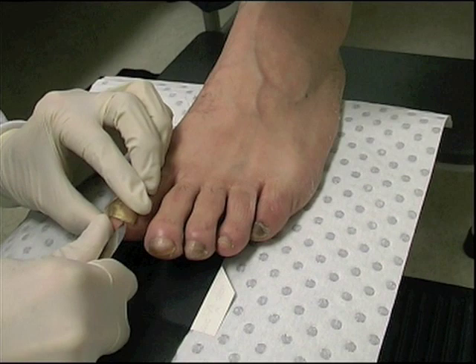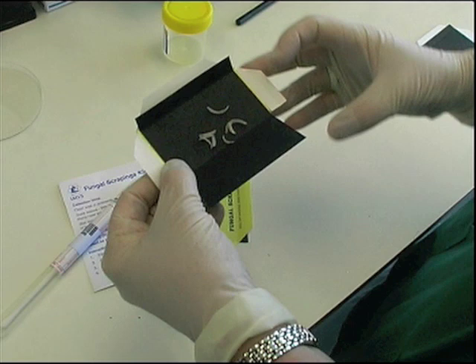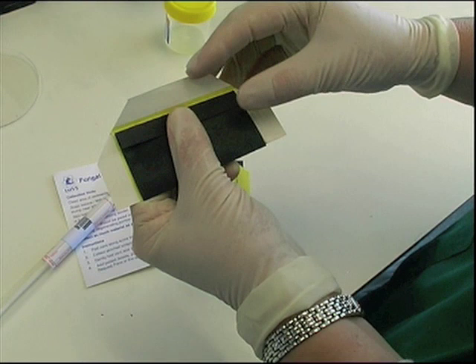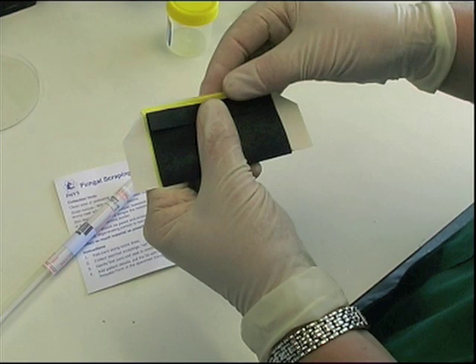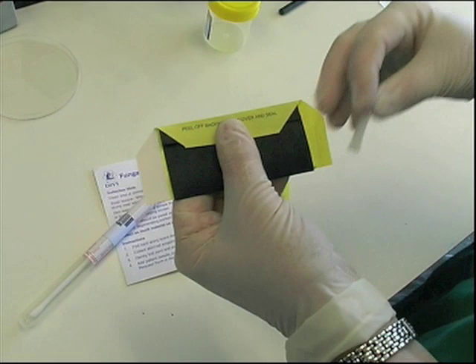Ideally, specimens should be scraped directly onto special black collection cards. These allow both the collector and the laboratory to clearly see the specimen. Cards may then be folded and sealed. Firstly, fold the bottom section upwards to cover the specimen. Then fold the top section over to close the card. While holding the card firmly closed, start at the top by bending the adhesive flap back to peel off the backing strip.